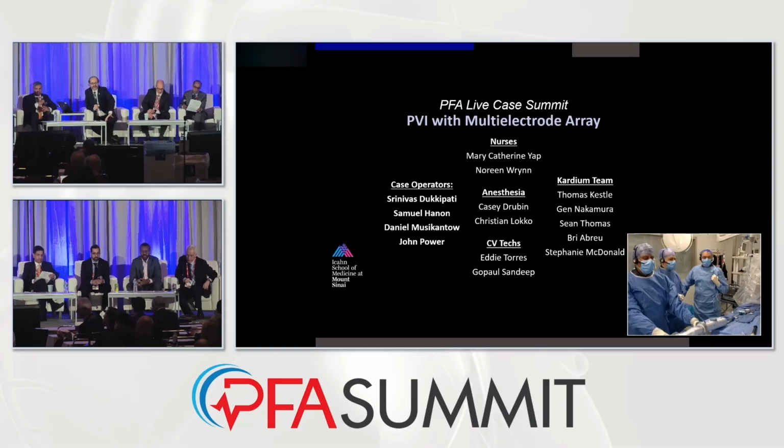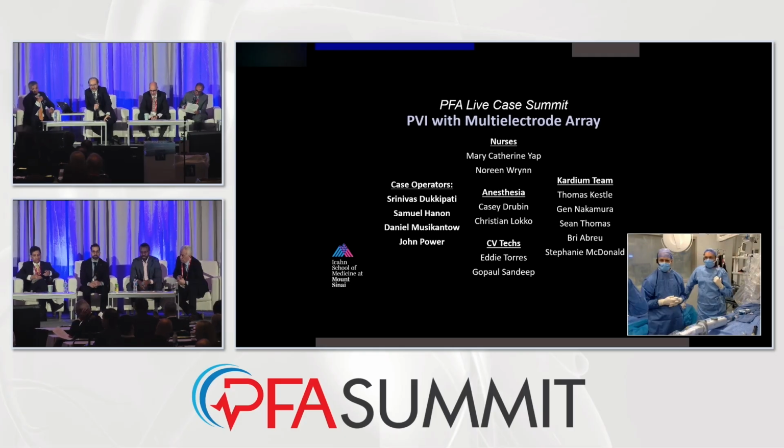We're going to move on to the next case. The next case is in New York at Mount Sinai. Srini, can you hear us? I should note, by the way, this case is going to be with the multi-electrode array, the Globe catheter. This is FDA approved, so okay, good. This is available to people.